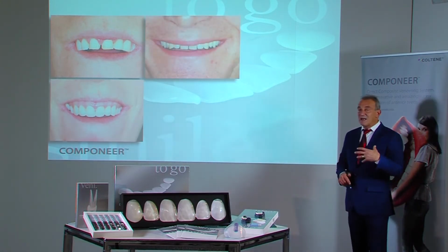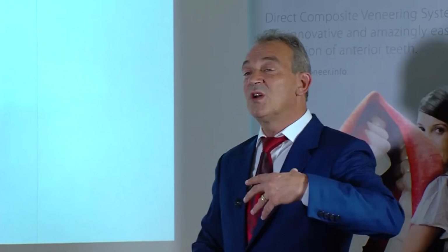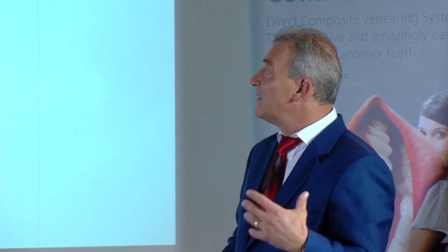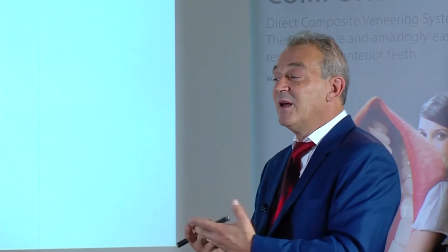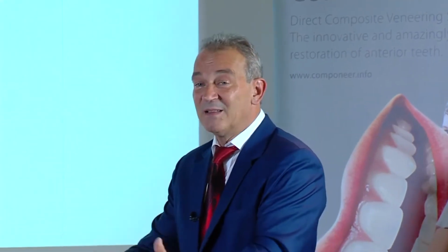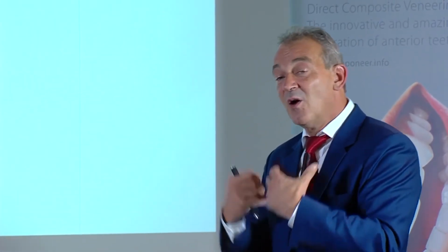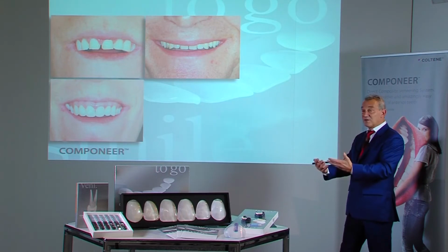In most cases, the objective can only be achieved by complementing, in other words, by adding. And this is exactly the advantage of Componeer. Componeer enables an additive approach. There's no need to first remove tooth structure in order to complete things later.